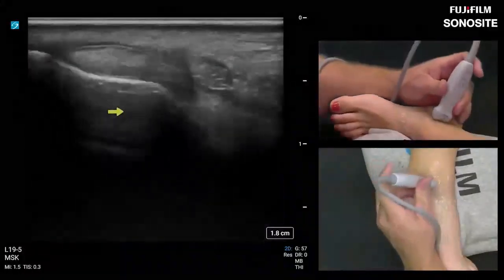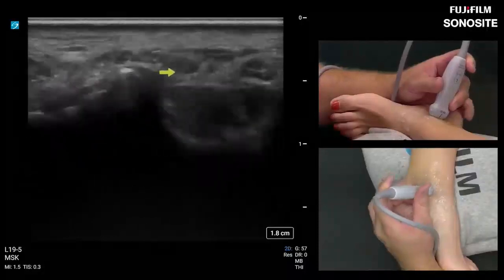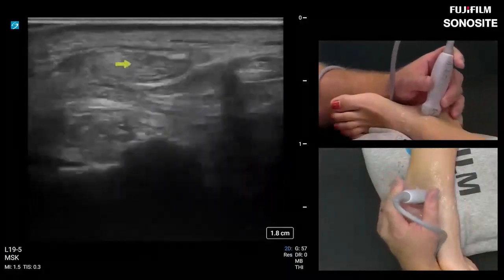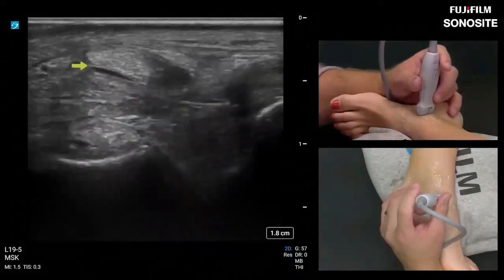I flipped my orientation again. Sorry about that. So tibialis posterior, FDL, and then you can see that really nice FHL. And then let's go look at the tendon sheath of the PTT right there. You can see a normal synovial slip right there, that little anechoic area.